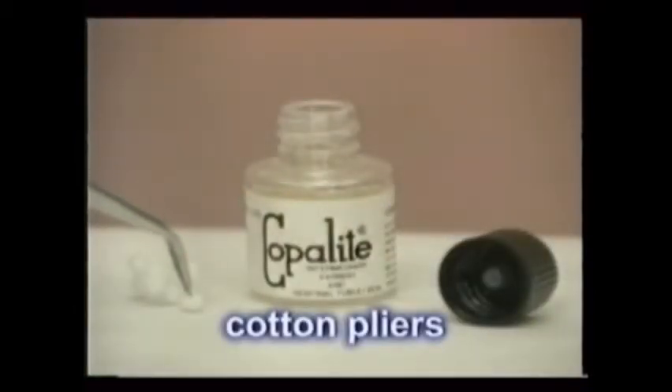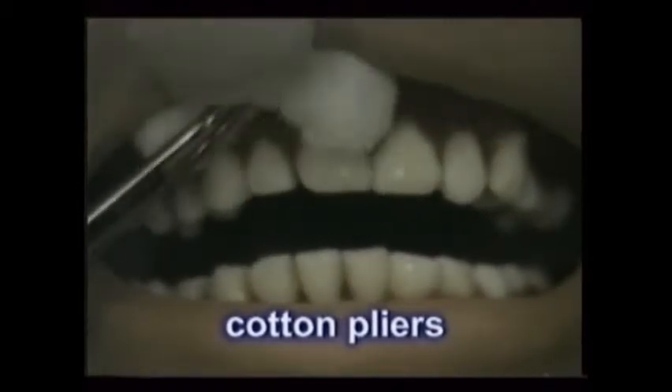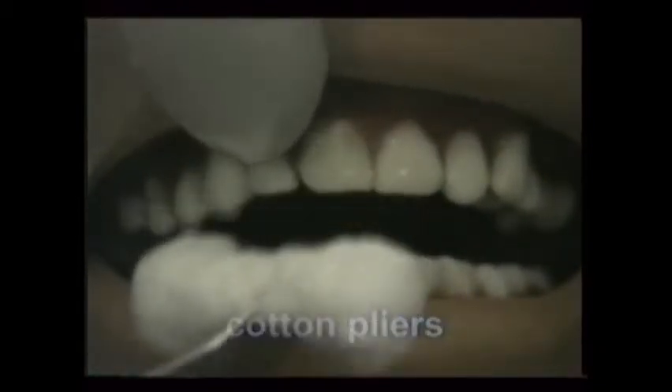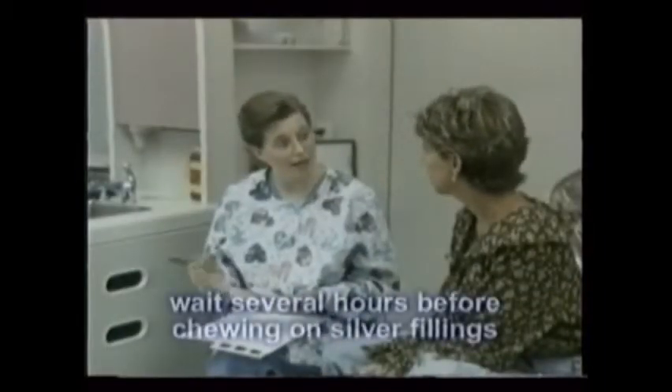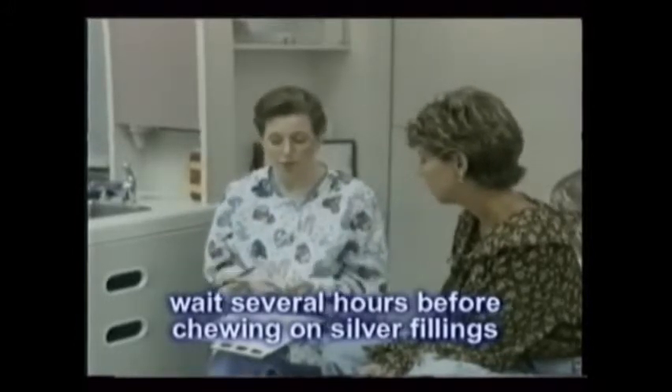Cotton pliers with or without locking handles are used with cotton pellets to dry, moisten, clean, or otherwise treat small areas of the teeth. The cotton pliers can also help you retrieve gauze and cotton rolls from within the mouth. Make sure that the patient knows to wait several hours before chewing on any teeth that have been filled.